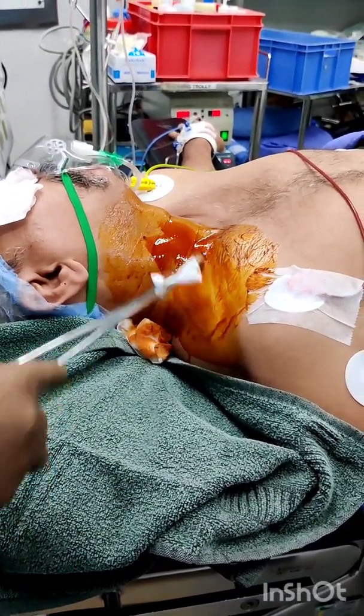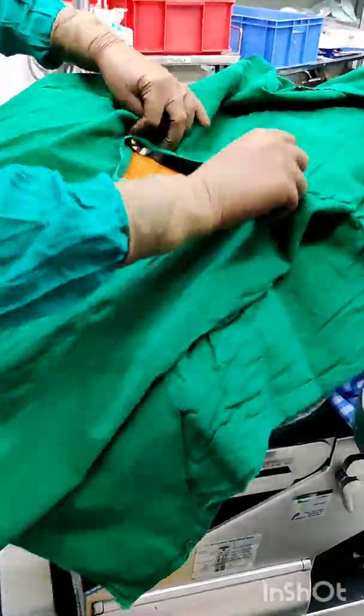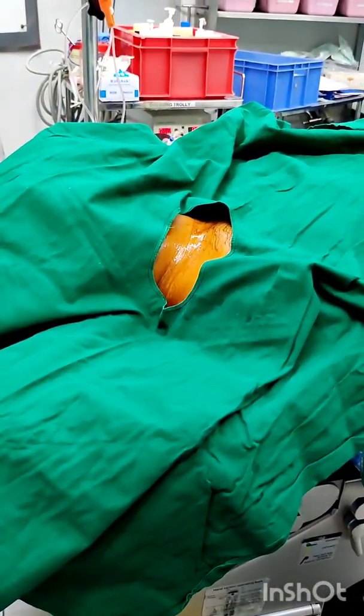Patient was given supine position with head turned to the contralateral side. Position the head at the end of the pillow to have enough space to scan. Using all aseptic precautions, anterolateral part of the neck is painted, prepared and draped.